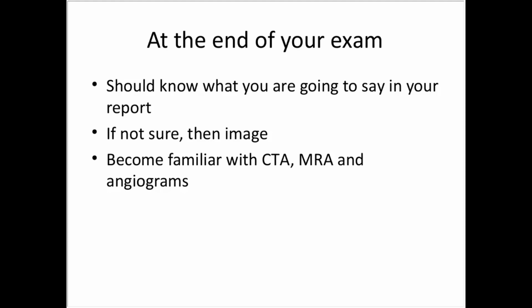At the end of your exam, you should know what you're going to say in your report. If you're not sure and you have the availability, image your patient. Become familiar with CTAs, MRAs, and angiograms.